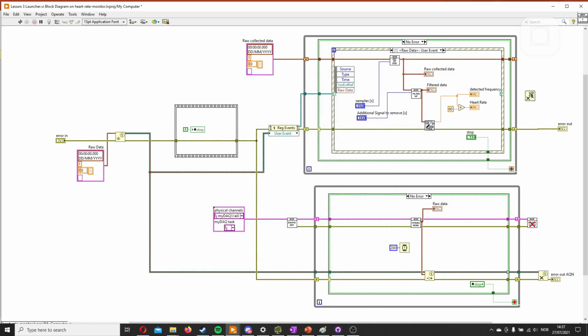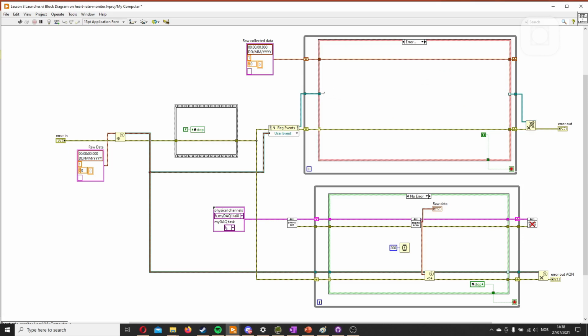And then we need to connect up this one because this registers an event and then it's good to close it. It's not vital. I didn't use it in the beginning, but there's some uncertain errors which can occur if you don't do it, and uncertain errors is the worst to debug. Then we'll just hook it up to this one. Oh, we see this missing an input here, so we will go to the error loop.